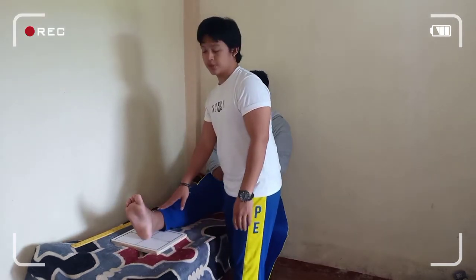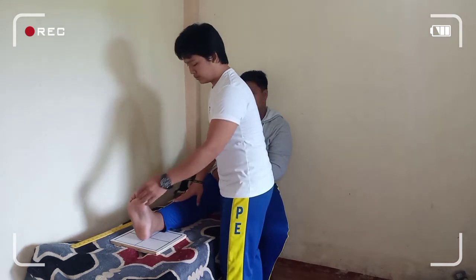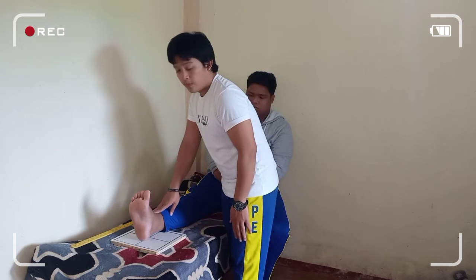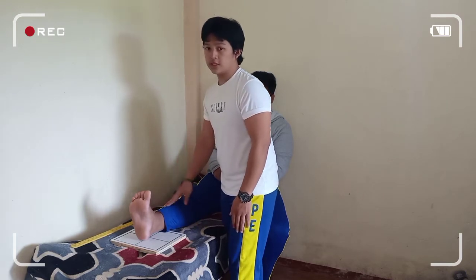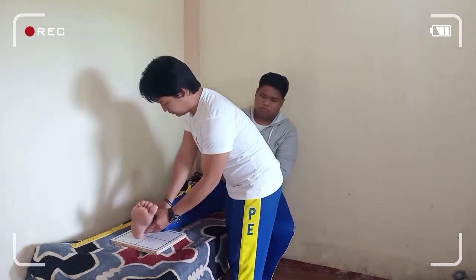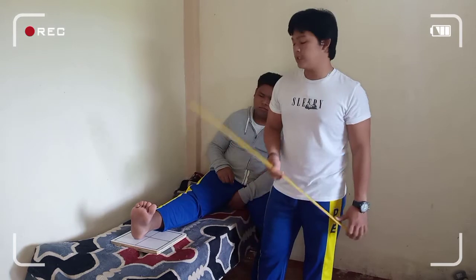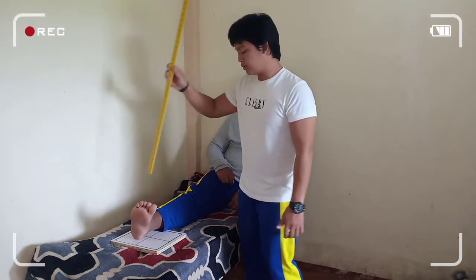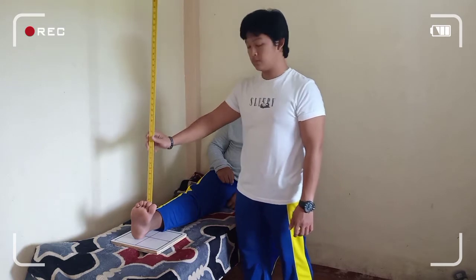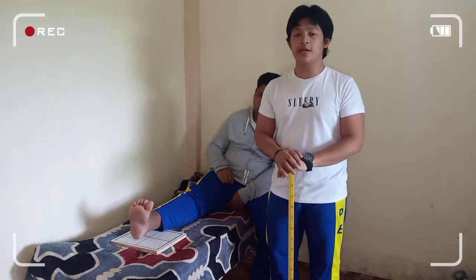Place the ankle in anatomic position with the foot pointing upward, and rotate the foot 15 to 20 degrees internally. The central ray must be perpendicularly directed to the ankle joint. The structure shown in this projection is the entire mortise joint.